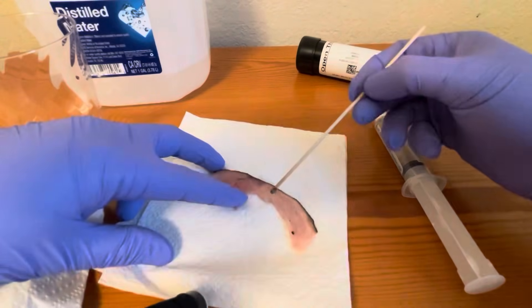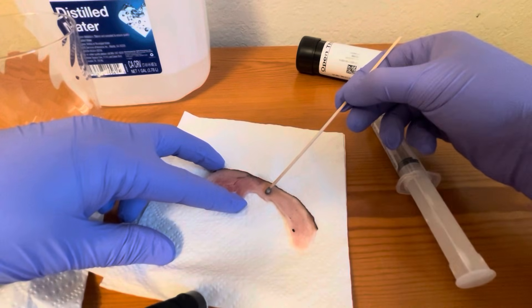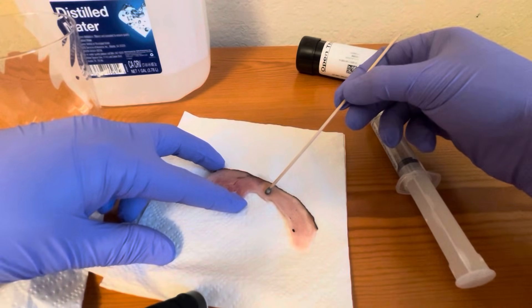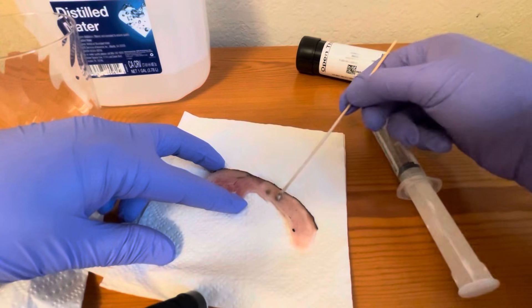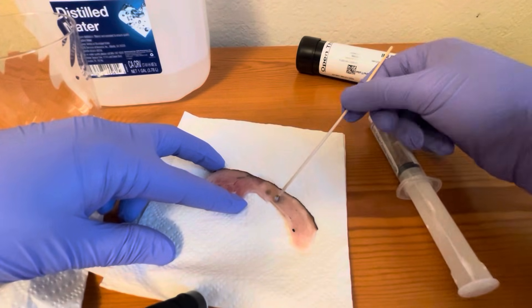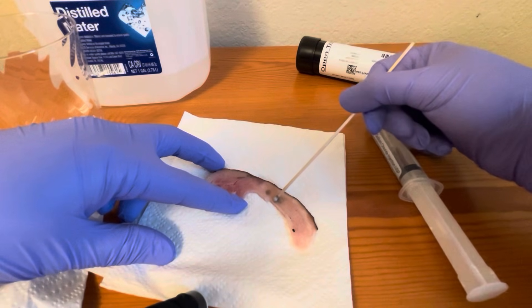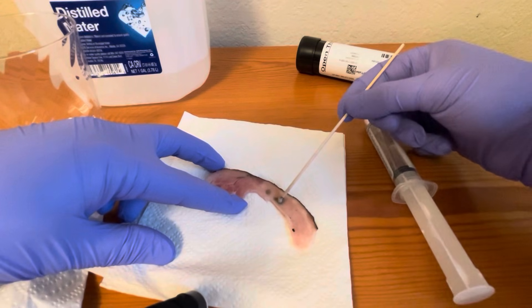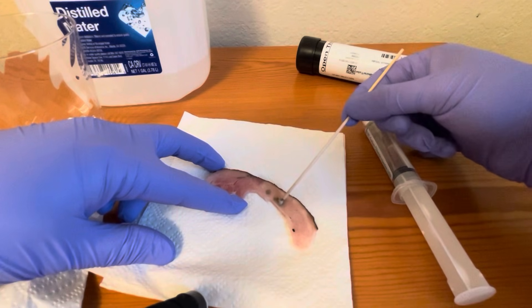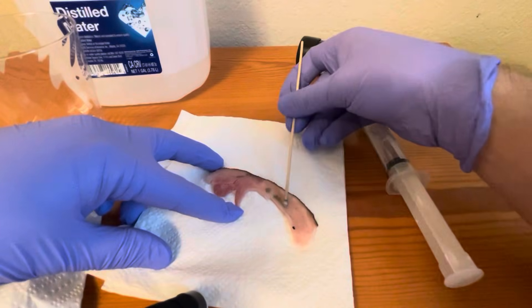You can rub it, or you can rotate the tip along the affected tissue. The technique varies depending on your granulation of the tissue and how you want to proceed — all different methods will help because the silver nitrate is activated and it's going to help break down the hyper-granulated tissue.